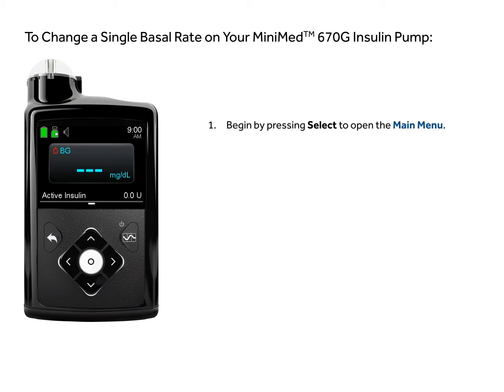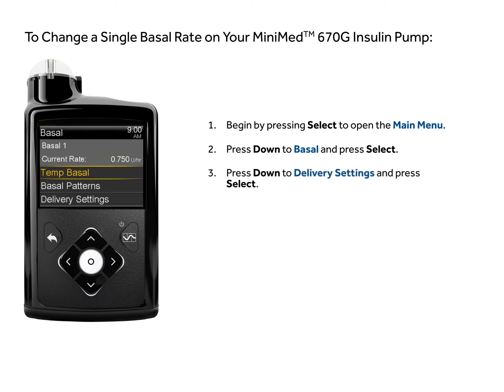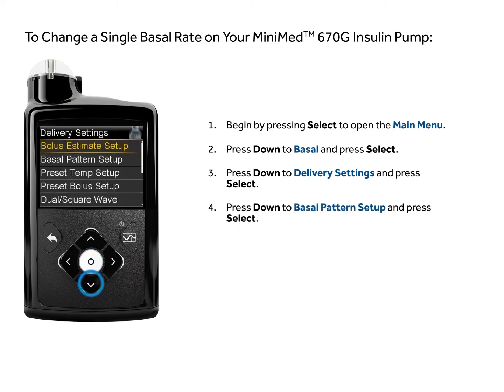Begin by pressing select to open the main menu. Press down to basal and press select. Press down to delivery settings and press select. Press down to basal pattern setup and press select.